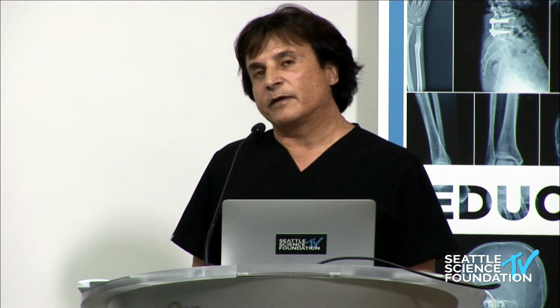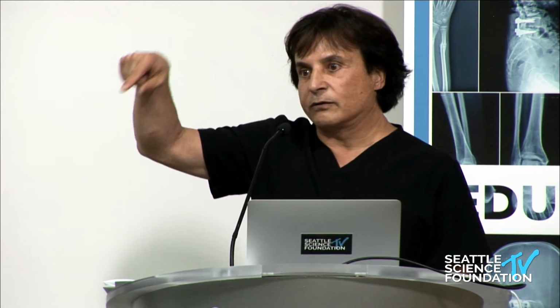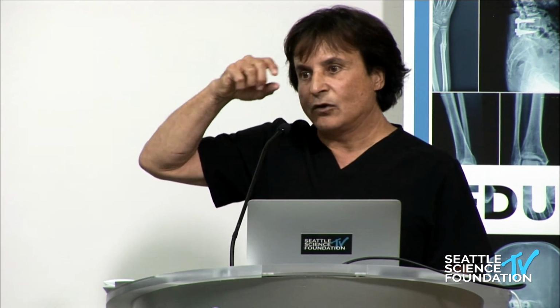Addressing it from the front, I think you still can. I think you still have the same problems going at it from the back as you do from the front. But from the front, what I would do is kind of a reverse Bohlman, where I would do a fibular strut through the disc space from the anterior aspect.